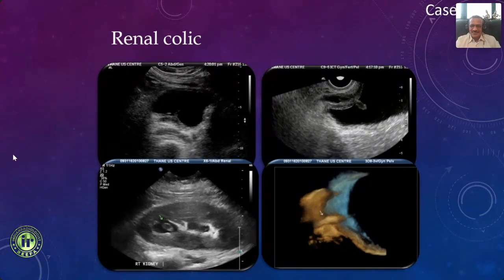Fantastic. Sloughed papilla we got, followed by papillary necrosis. So I think it's good enough. Very good. So the clue would have been a diabetic patient. So here again, two things. One is this patient had colic, and the clue is the sloughed papilla in the kidney, and you're seeing something in the ureter which is not shadowing.